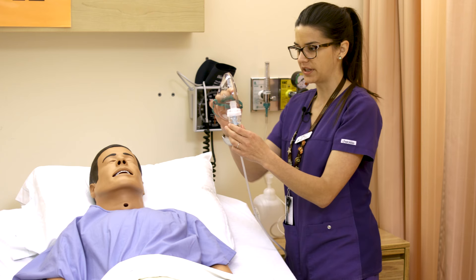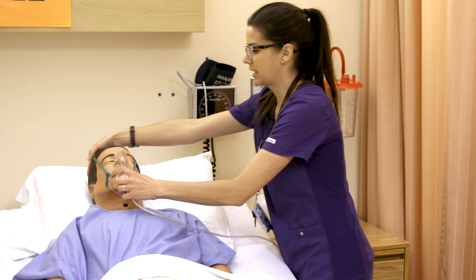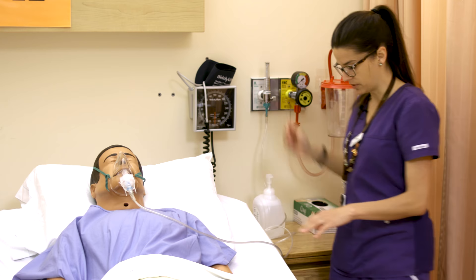The other method is with the simple face mask attachment — same idea. Turn up the oxygen and watch for the mist, about seven liters this time to get it misting, then attach it to the person's face.